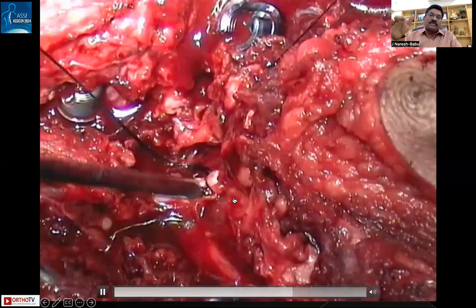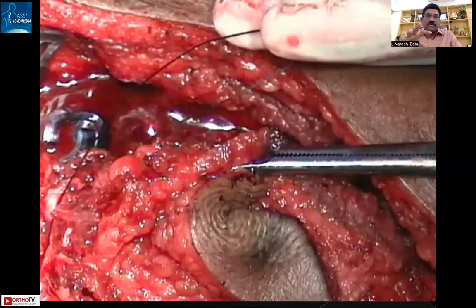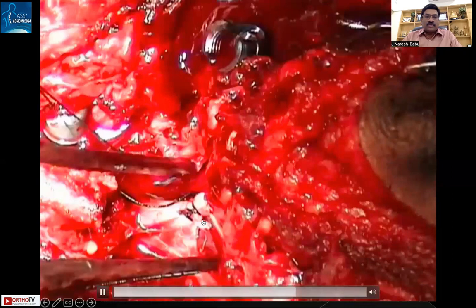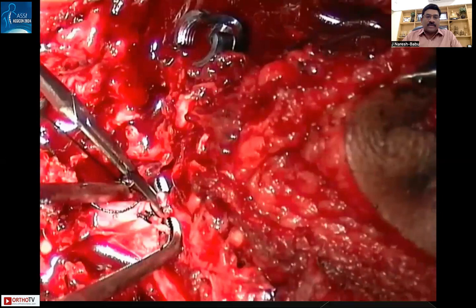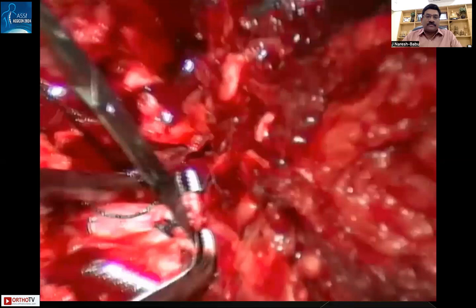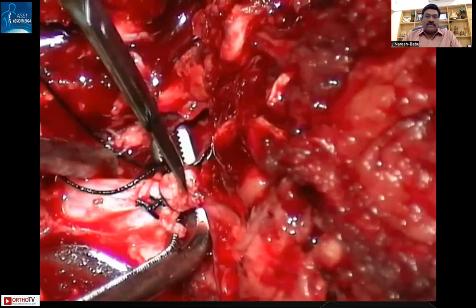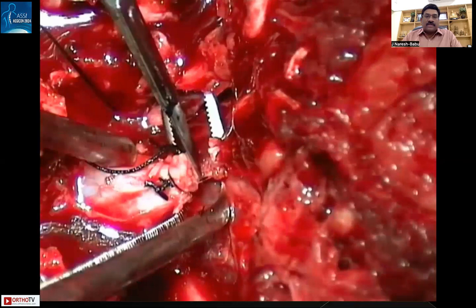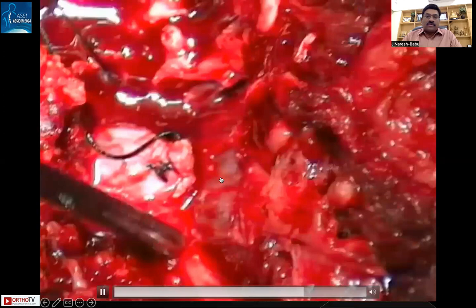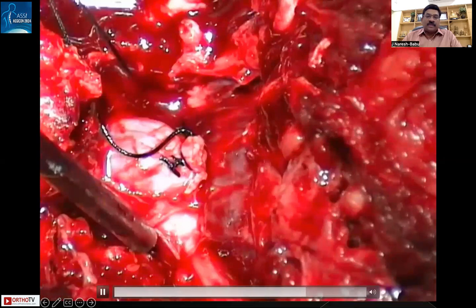This mass contains all the nerve roots below the thecal sac — S3, S4, S5, and coccygeal segments — which all come out in a single mass when the thecal sac is cut and the tumor is removed. The thecal sac is cut, separating the tumor from the spine. Anteriorly the tumor is separated by discectomy, posteriorly from the nerves, and distally from the anococcygeal elements. Some tumor infiltration bridging the cortex is also visible here.